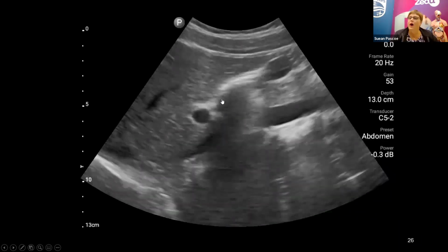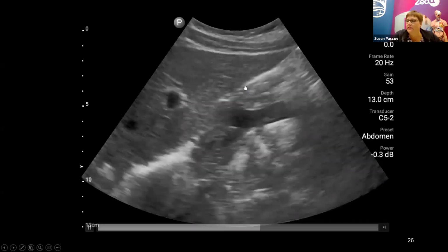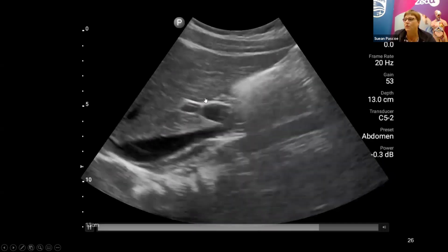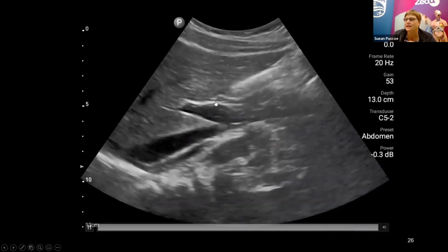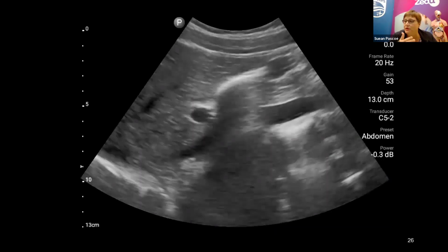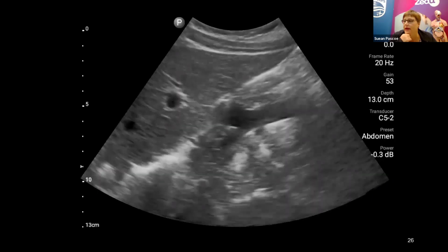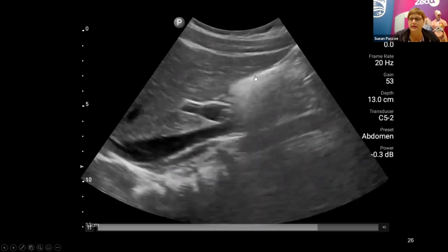This one is just quiet respiration, and during that respiratory cycle, you can track this bile duct along its length and see it along the entire length. I haven't necessarily got it all in one view, but during the course of that respiratory cycle, you can track it pretty much the whole way along over to the pancreas and see that it's clear.